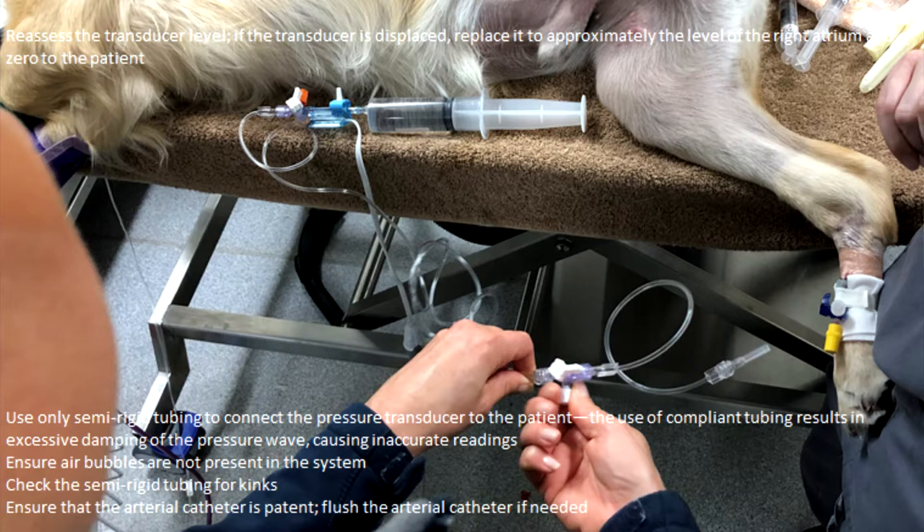For troubleshooting: make sure your transducer always stays at the level of the heart — it's easy for it to shift when moving in and out of theatre. Make sure you're using pressure transducers with semi-rigid tubing, because compliant tubing causes overdamping, giving a very flat waveform. Overdamping can also result from air bubbles, kinking, or a small clot at the tip of the art line. Underdamping produces a very spiked, exaggerated waveform. Air bubbles can cause either over- or underdamping, so check for kinks and ensure the art line isn't blocked if you're not getting a reading.